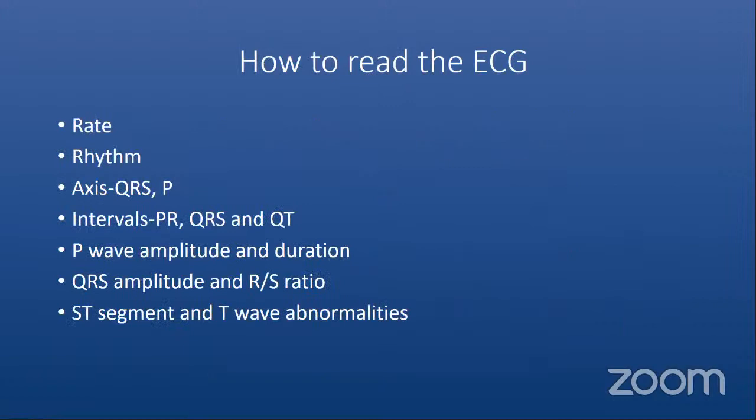So how to read the ECG, basically. There is a systematic approach, and that is the same for neonates as well as for adults and older children. If you remember the sequence, or just follow your own sequence, then obviously you won't miss anything. So first of all, you have to look at the rate.